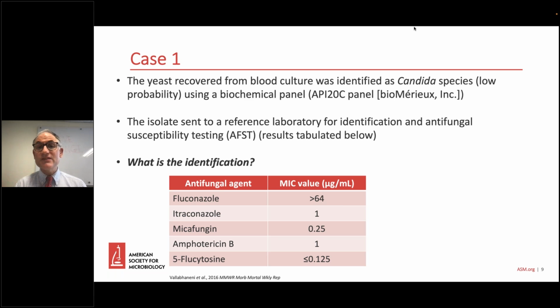So I'm going to ask you, based on the time period, so it was 2016, the clinical presentation of the patient, so heavily immunosuppressed, and the susceptibility profile, just want you amongst yourselves and to your friends, maybe rattle off some possible identifications. So I'll just stop for a second and let you do that. So I really want you to take into account the susceptibility profile.